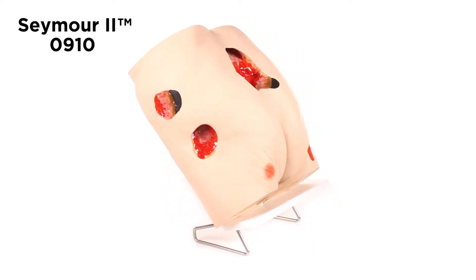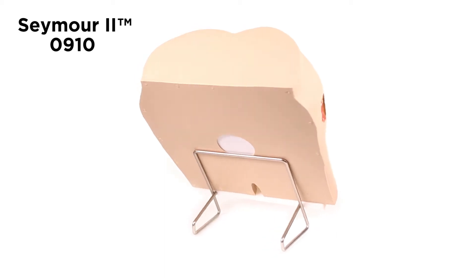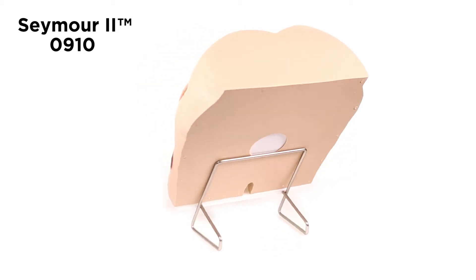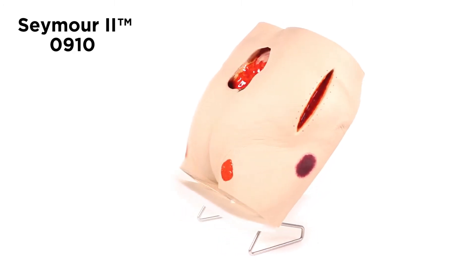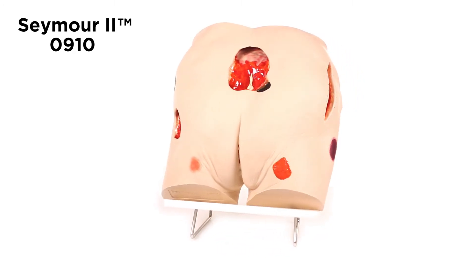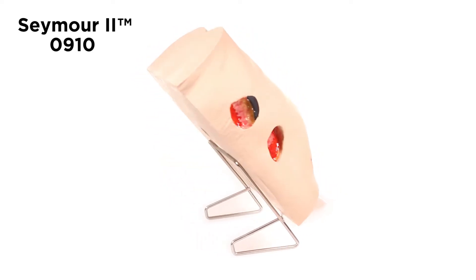Seymour II Wound Care Model 0910 is one of our most popular wound care models. Seymour was molded from a 74-year-old woman with amazing detail. Seymour displays stage I through stage IV pressure ulcers, suspected deep tissue injury, an unstageable wound, and a dehiscent wound.